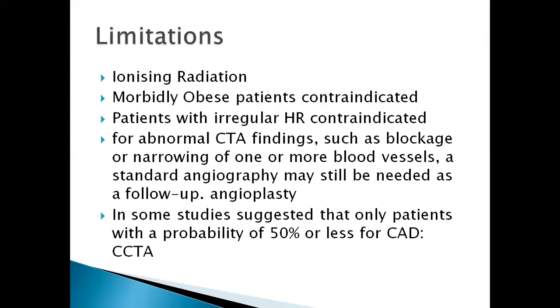Also, children, this makes it not the first option if you want to assess for any anomalies, let's say congenital anomalies in a child. And the radiologist will mostly recommend that the doctor considers other modalities. Also, morbidly obese patients, because they are contraindicated, this is their limitation. Patients with irregular heart rates.